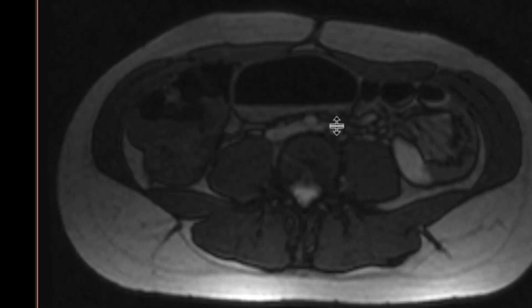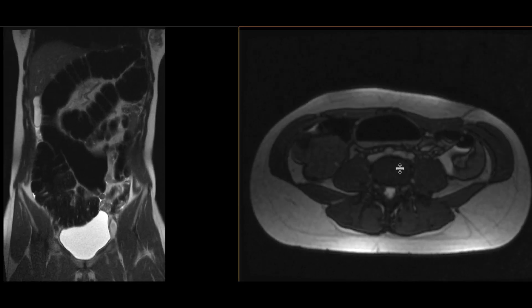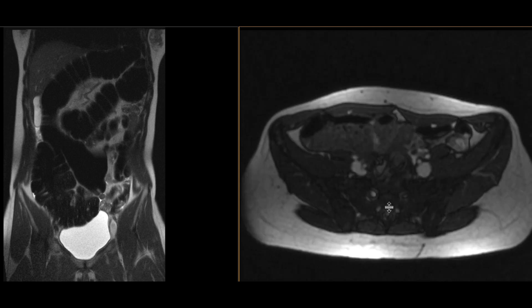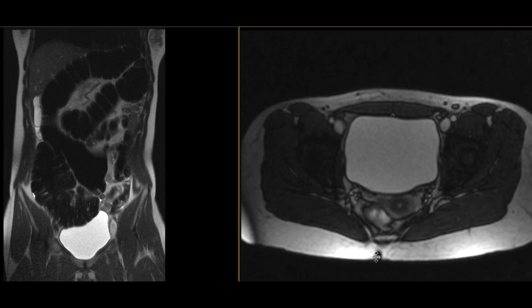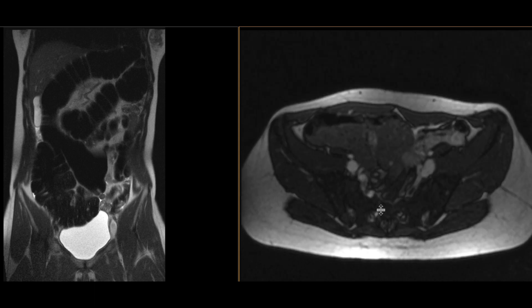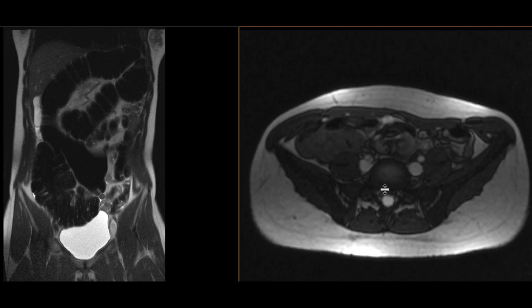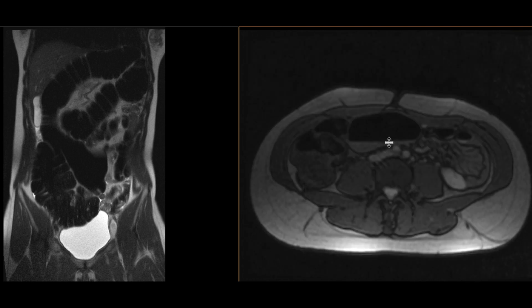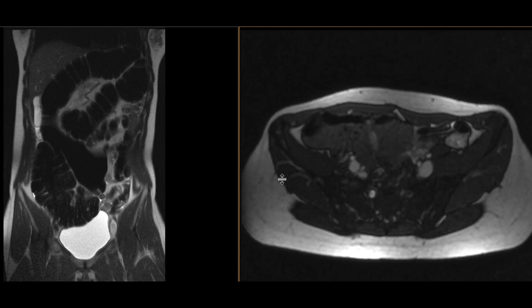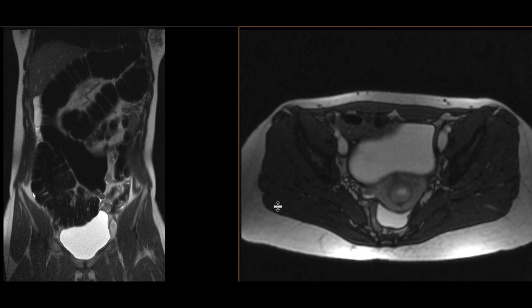These findings are classic for a sigmoid volvulus. We often see this on X-rays or CT scans. This was a different case in which we were able to diagnose this on MRI imaging due to the fact that this patient was pregnant.